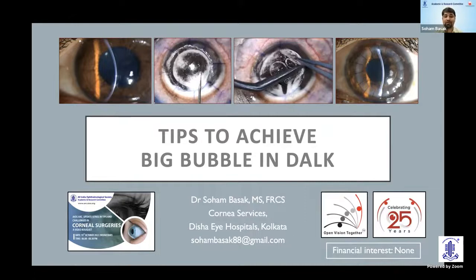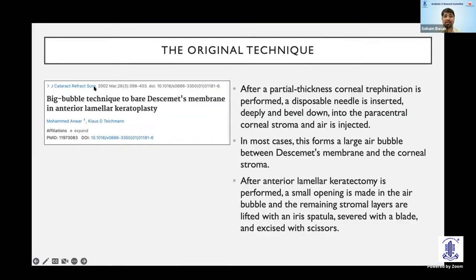So I'll be talking about tips to achieving big bubble in DALK surgery. I have no financial interest in this talk. And in fact, we are actually celebrating 20 years since Anwar described it way back in 2002.